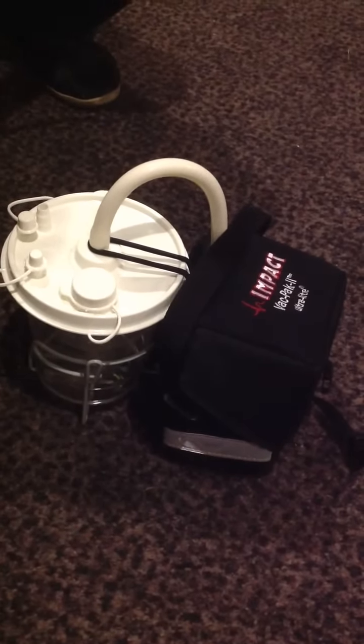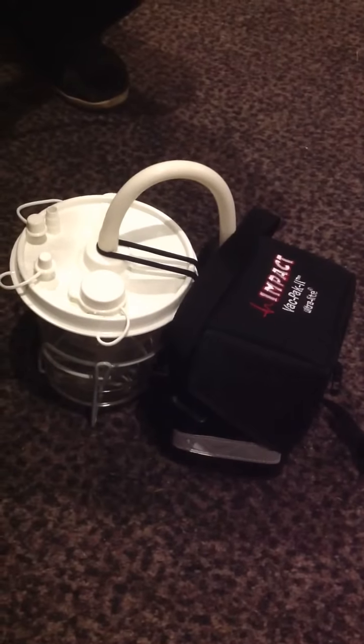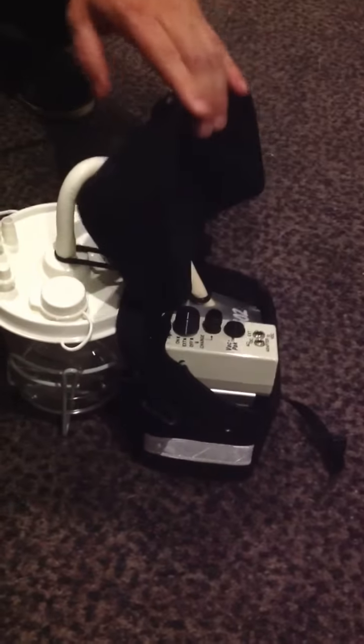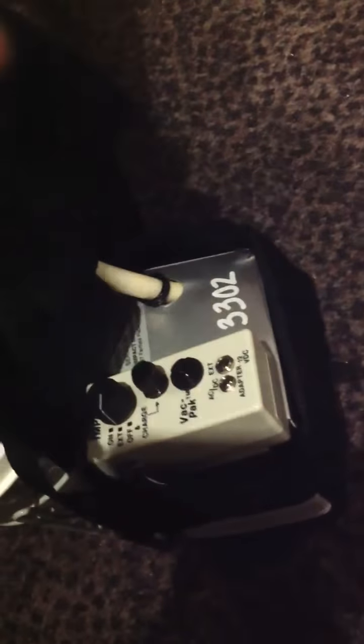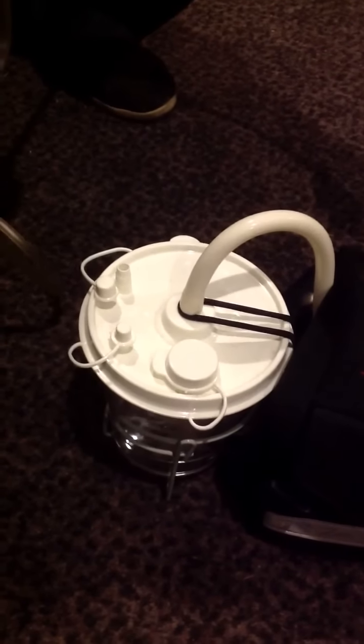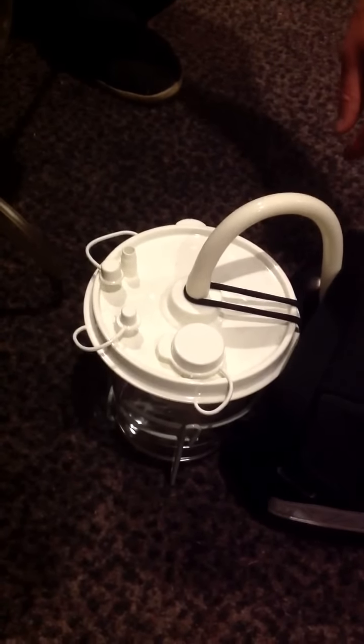The entire suctioning device is composed of several parts. There is a power source, which consists mainly of an on and off switch, and when turned on, it's quite loud. The power source is connected to a canister, which serves as a reservoir for the material that is suctioned out. And the canister has multiple plugs that can be attached to other things.